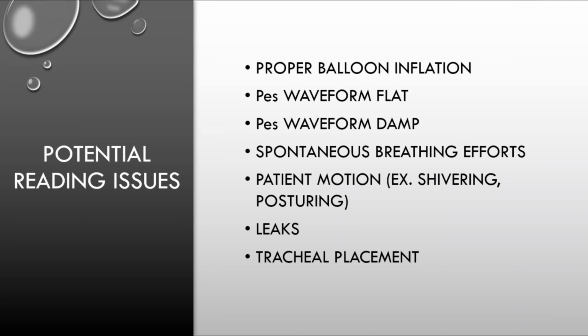So, potential reading issues: again, proper balloon inflation using the three-way stopcock. We've got to make sure we're all doing that the same way and that we're taking consistent readings. You can have a flattened or dampened waveform if the balloon isn't inflated properly.